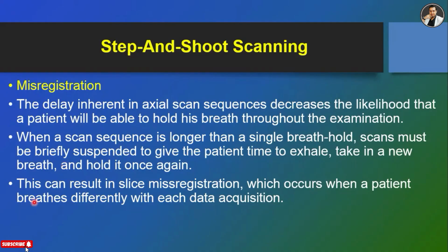This can result in slice misregistration, which occurs when a patient breathes differently with each data acquisition. This is a very important point. What is misregistration? When a patient breathes differently with each data acquisition, the slices no longer line up.